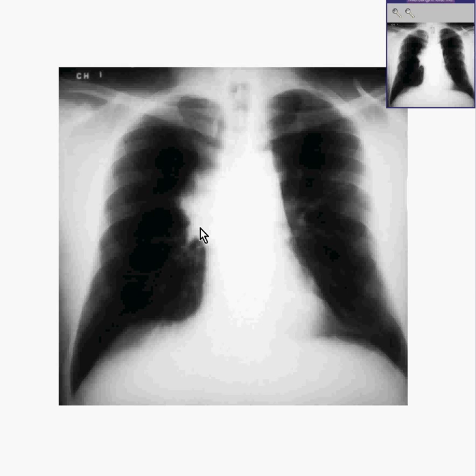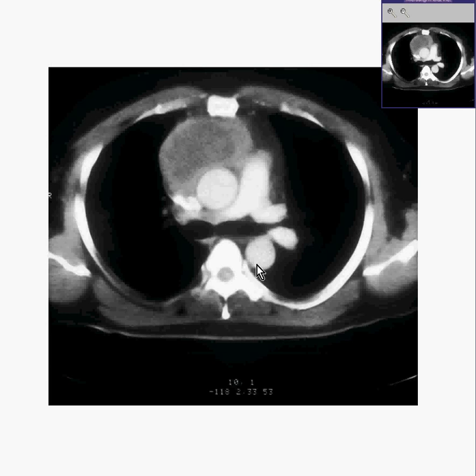I don't know. But here is a chest x-ray in which you see some tumor replacing, on the right here, the mediastinum. It's doubtful or perhaps possible that this could be from the lung, but it looks like it's more in the mediastinal area. CT could very easily help differentiate this. And in the CT slice of this plane, I think I could convince you very easily that we have rather well-defined round nodules, which don't look like they are directly part of the lung, but may compress the lung. These are mediastinal lymph nodes. They're very big. It's probably a lymphoma unless we can find any primary cancer somewhere.